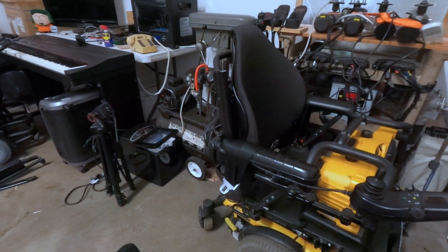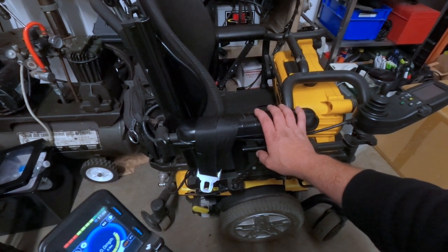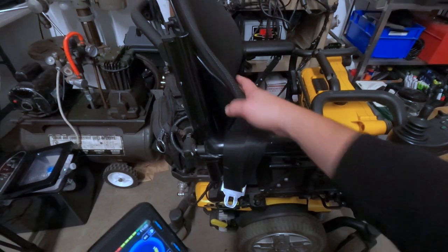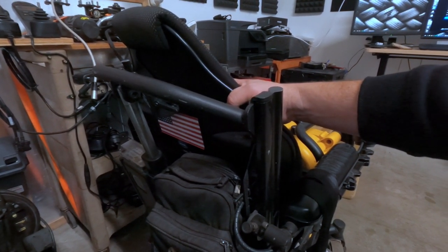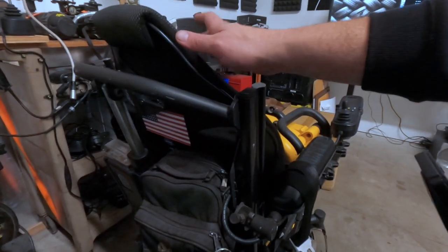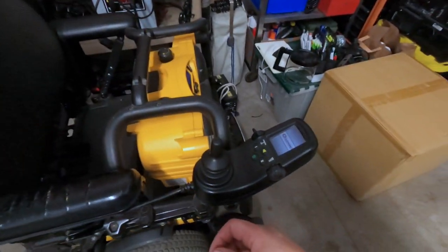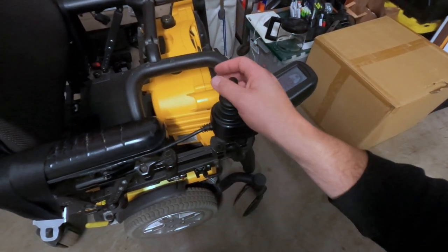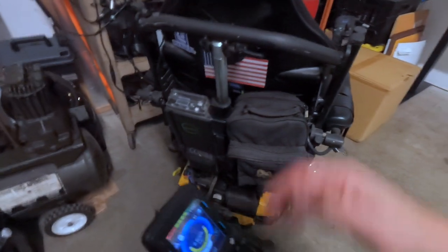I've decided I'm just going to use the backrest off of this other chair — it will take my backup backup backup chair offline, but I haven't needed it in a while and there are already two other backups in place. This seating was from my very first rehab chair — originally an Invacare TDX SI2 with van seating, but then they put this ultra-low Motion Concepts stuff on it and this was the original seat back. In theory it's compatible with this TDX SP2. This seating system was never sold on Quantum — it's Motion Concepts seating on a Quantum Q6 Edge 1, so you'll never see this out in the wild.